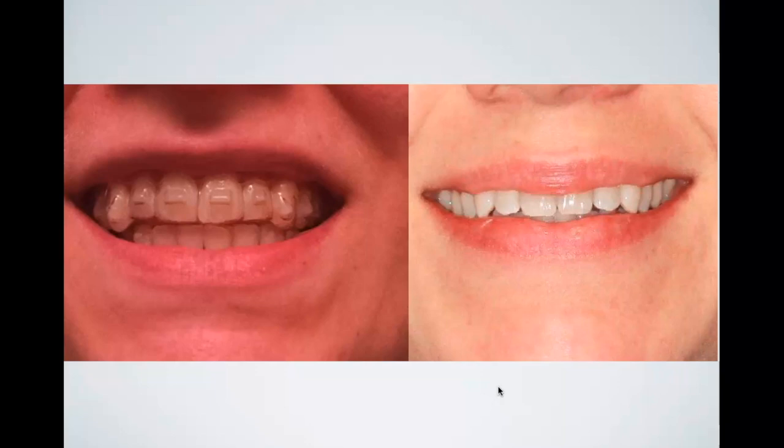So with 3D printing, you can actually print the thicknesses in any part that you want to make the forces hypothetically ideal. The other cool thing about 3D aligner materials is that they are thermoactive, meaning that when you put them in boiling water, they're restored to their original shape. So when we put an aligner in our mouth that is not fitting, meaning that we've reset a tooth, we want to move something, right? When you put it in there, the aligner's not going to fit to some degree. It's going to put pressure somewhere. That's what it's supposed to do.